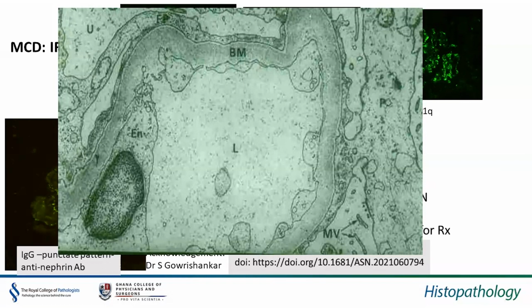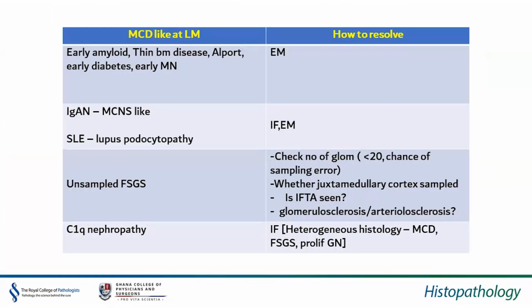At this stage, it would do well to remember that foot process effacement is not a feature that's exclusive only for minimal change disease. It can occur in any form of podocyte injury and any kind of proteinuric state. But the extensive foot process effacement, in conjunction with the rest of the clinical scenario and the rest of the biopsy findings, is very characteristic of minimal change disease.